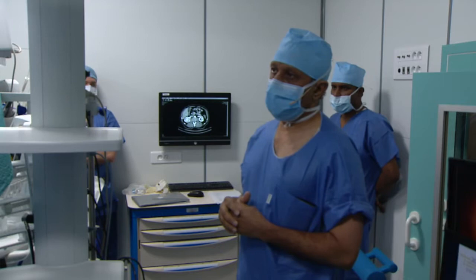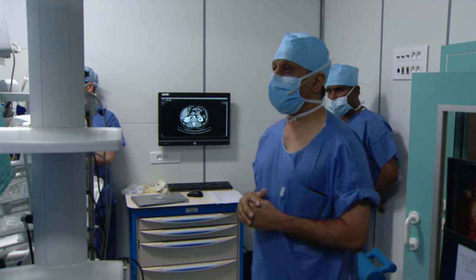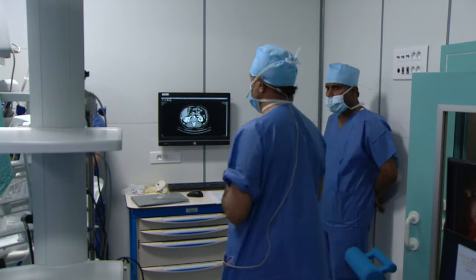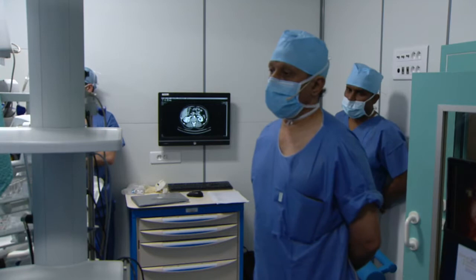He's 73, he has a coronary history. His creatinine is fine, his opposite kidney is fine, and while a partial would be good, it is not critical. And so our threshold for converting to a radical nephrectomy would be low. If he had somewhat greater cardiac issues or was obese, et cetera, we would just do a radical nephrectomy right off the bat. And I would not criticize anybody who said, why even try a partial, just do a radical. That would be a very logical point, and I would have no problem with that approach either.